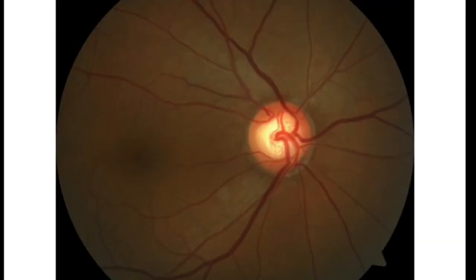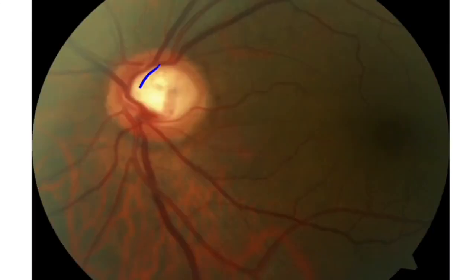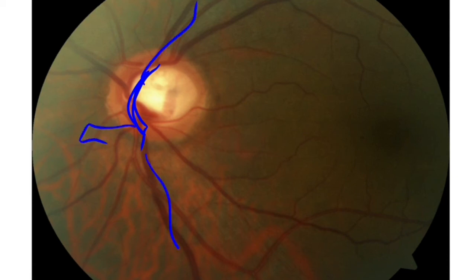Next, coming to the appearance of vessels over the optic disc. Normally when the neuroretinal rim is intact, the vessels usually pass perpendicularly through the disc tissue to reach the retina. Now because there is NRR thinning, there will be changes in the appearance and the way the vessels pass through the optic disc. One of those is the circumlinear vessel. As the cup enlarges and there is thinning of the optic disc on the nasal side also, the vessels are dragged towards the nasal side. So that gives the appearance of nasalization of the vessel.